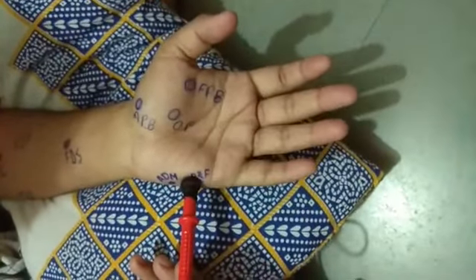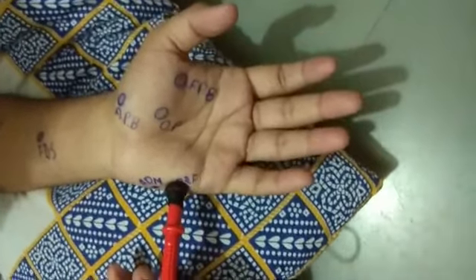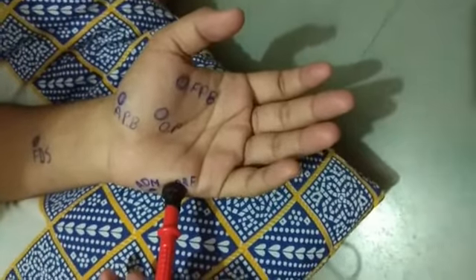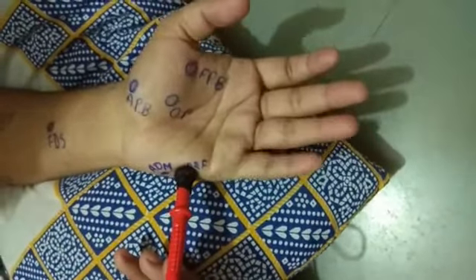This is the motor point for the flexor digiti minimi and opponens digiti minimi. The action of flexor digiti minimi and opponens digiti minimi is opposition with flexion of the little finger.